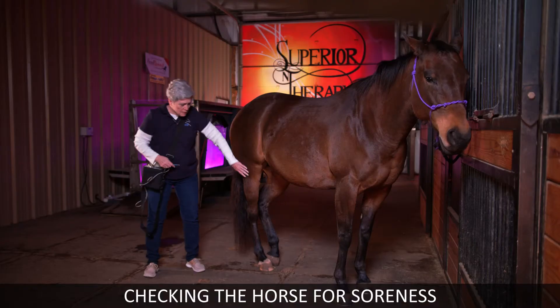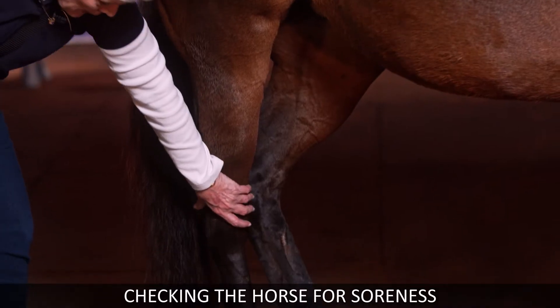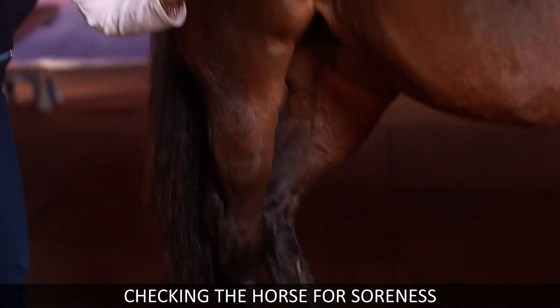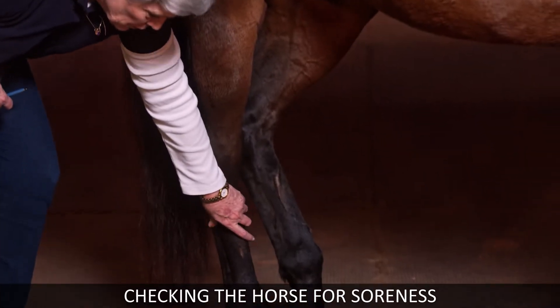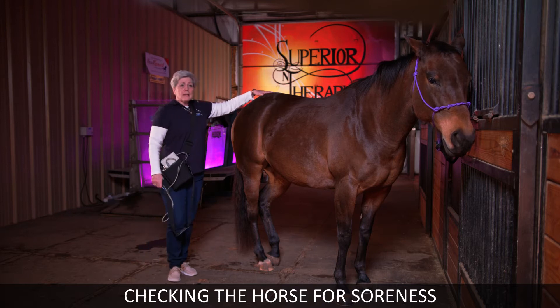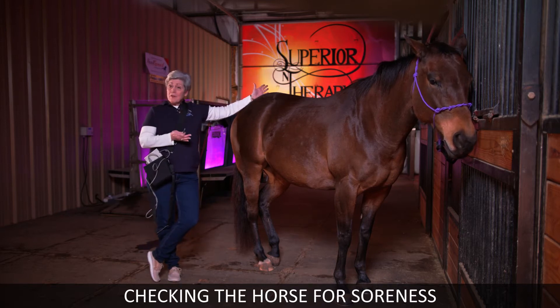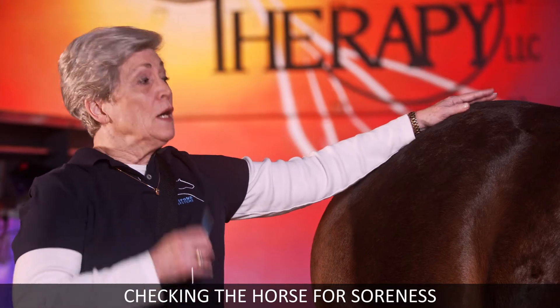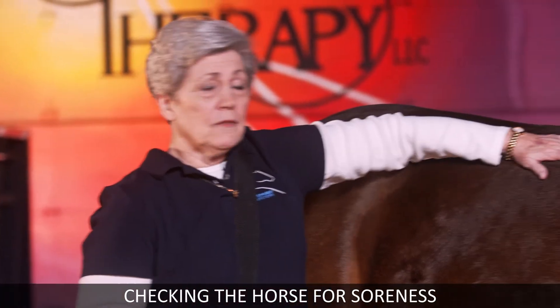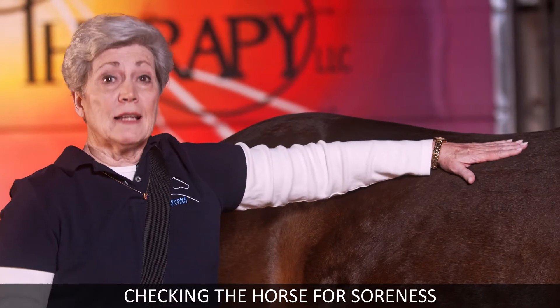Take your hands and feel for any swelling — usually you can feel heat in your hands too. Go down and check the legs like that. These horses are at Summer's, and I can't find anything wrong with them to show you. But the idea is: if you've got a place they flinch, you treat it, and then go back and check it again.